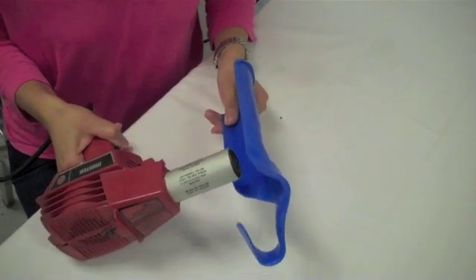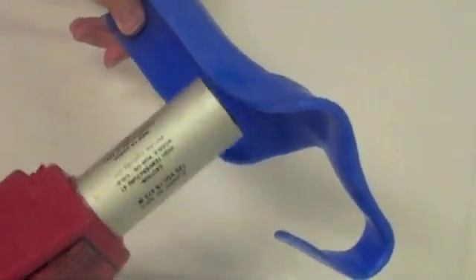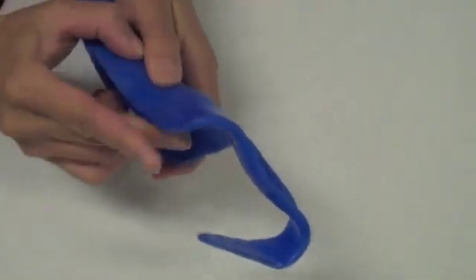Use the heat gun to make adjustments and smooth out the dry splint. Make sure to flare out the edges of the forearm trough so that it does not dig into the patient's forearm.